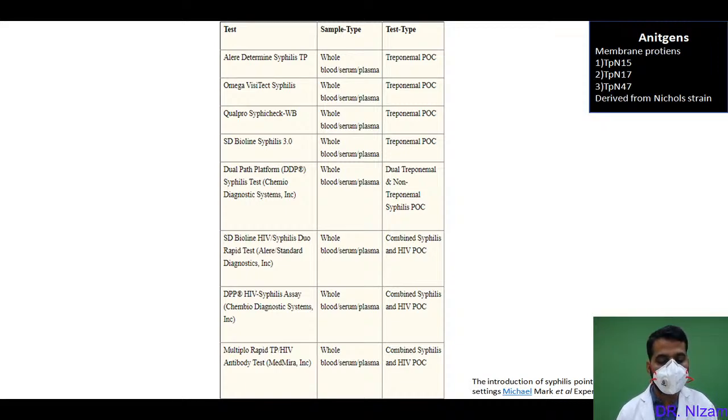Now with one more: POCT is ELISA based or agglutination based? It is ELISA. POCT, what is the format? ICT based. It is an immunochromatographic test, where it is coated with the colloidal antigen and then antibodies. It is neither of the two, ELISA or the agglutination. Okay, go on. Now we'll take the rest of the questions at the end.